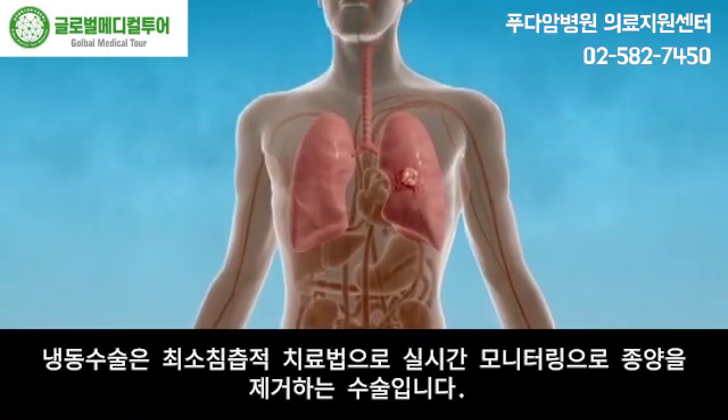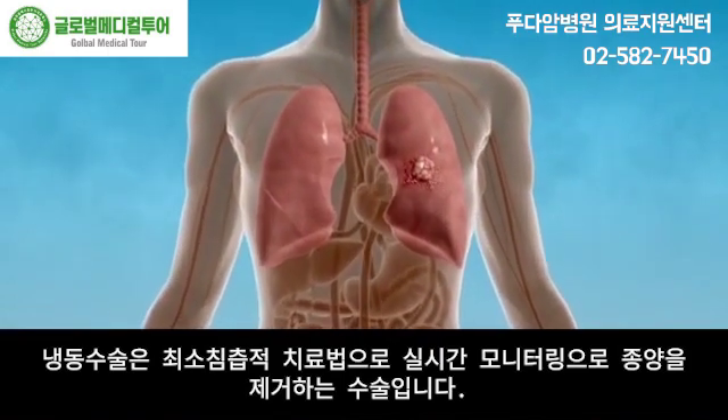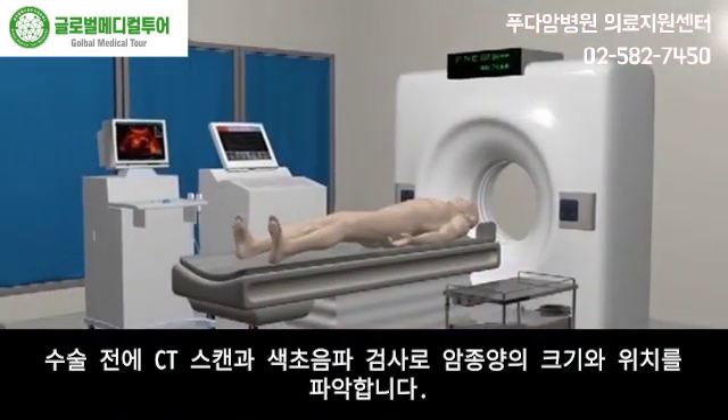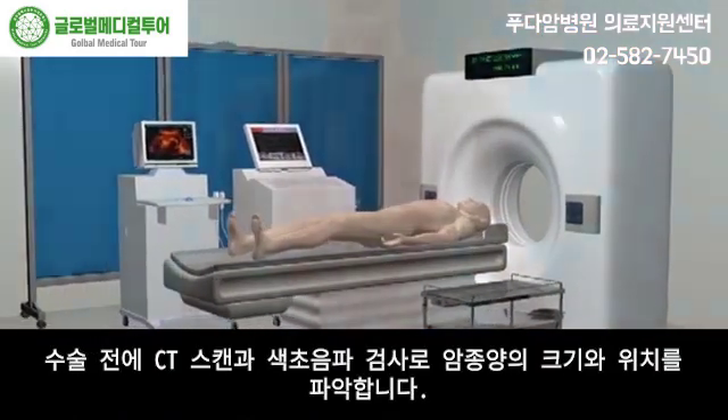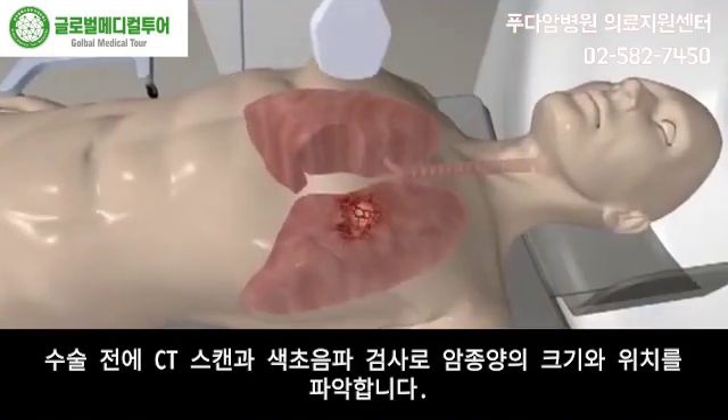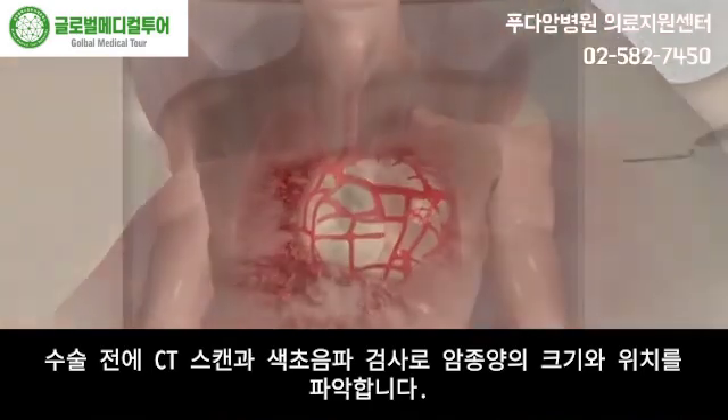Cryosurgery is a minimally invasive therapy which can ablate the tumor via real-time monitoring without removing it. Before the treatment, CT scan and color ultrasound examination are performed to confirm the tumor size as well as tumor location.